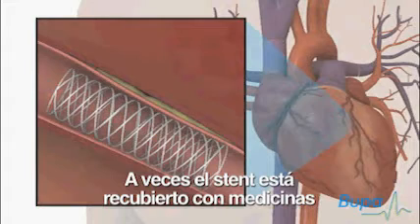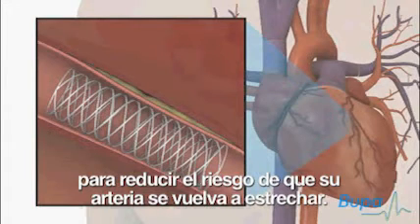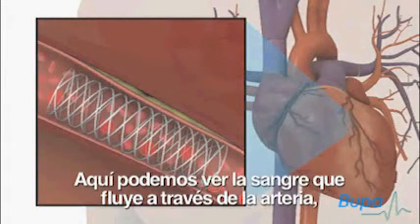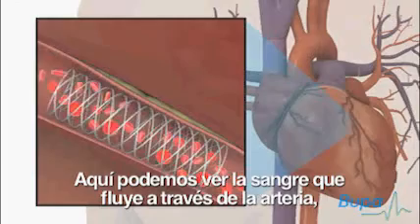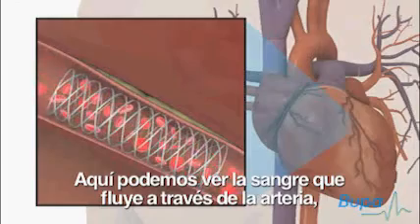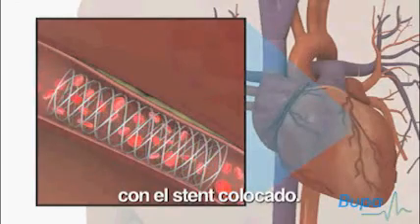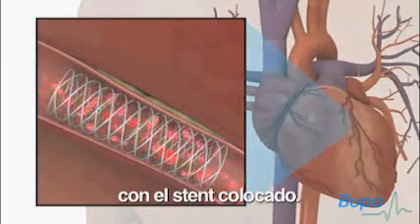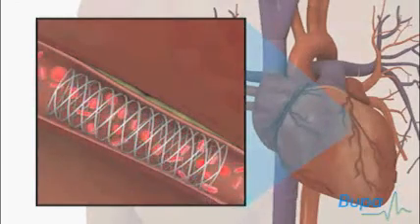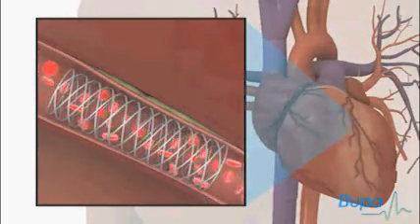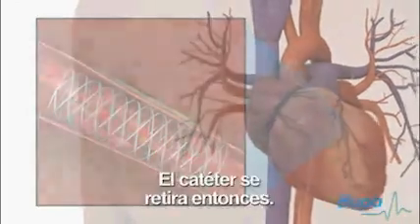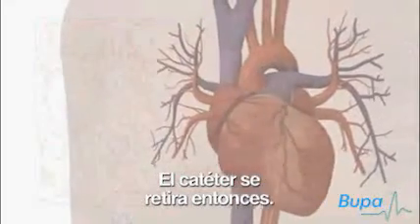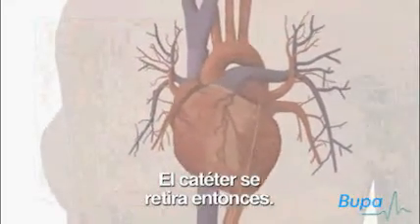Sometimes the stent is coated with medicines to reduce the risk of your artery narrowing again. Here we show the blood flowing through the artery with the stent in place. The catheter is then removed.